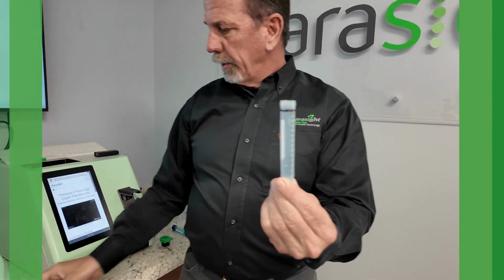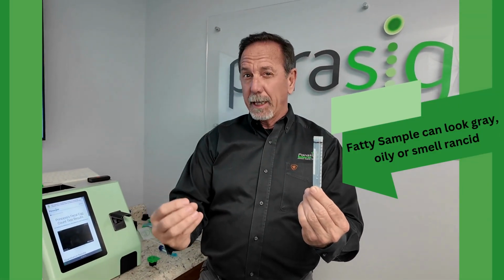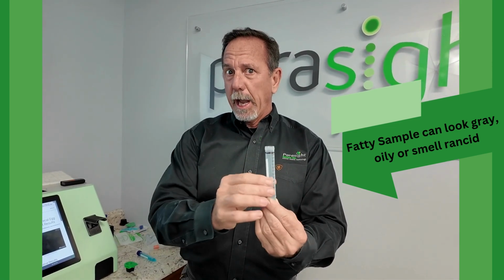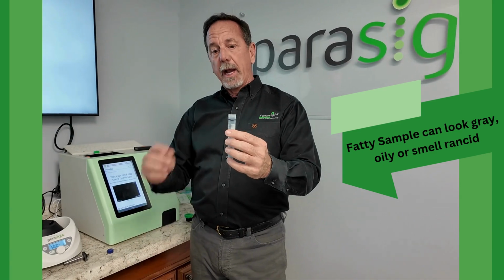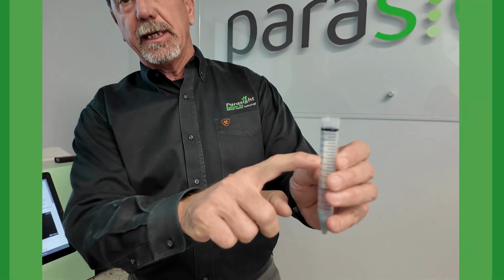I will tell you, usually when you do this, fatty samples smell rancid. They can look gray. They usually look like they have a lot of mucus on them. They look and act differently than a normal fecal sample. So you're going to put that in there, and then we're going to add water, just regular water, up to the 10 cc mark.